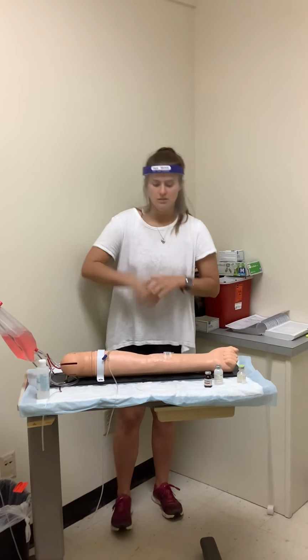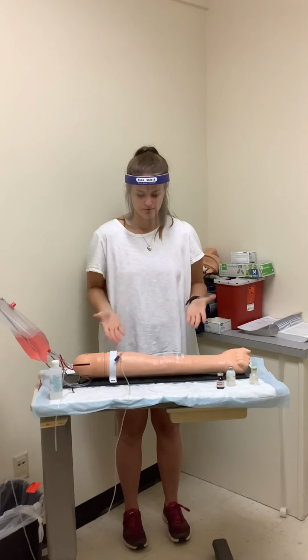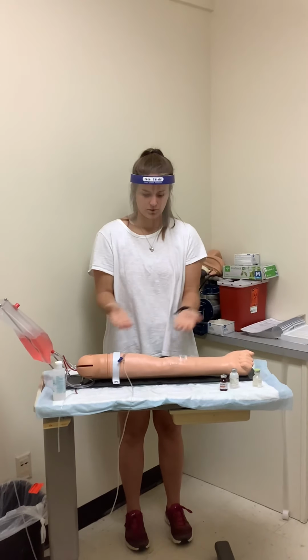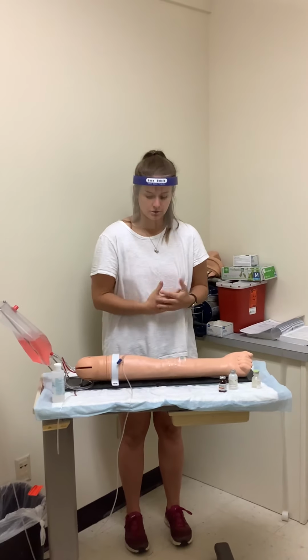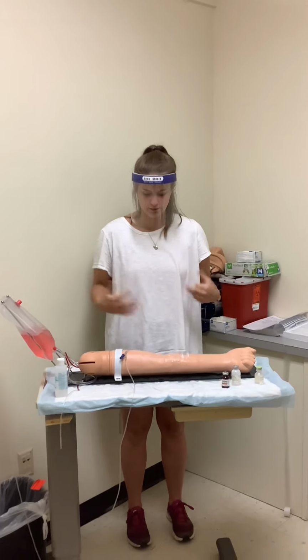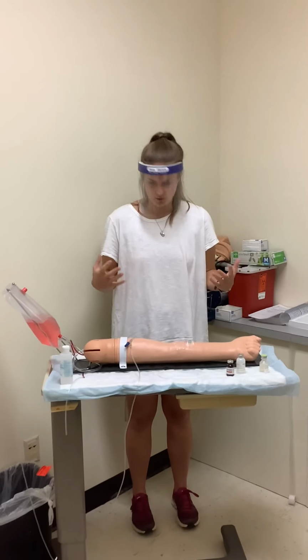So, hello, my name is Sage McKee. I'm a student nurse at MCC, and I'm going to give you your IV push medication by using the port closest to the IV site. You are getting furosemide, which is a diuretic, which all that's going to do is kind of get rid of some of the fluid that is in you. We have edema. And so I'm going to wash my hands.